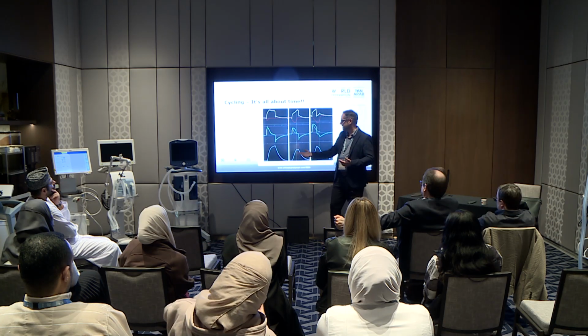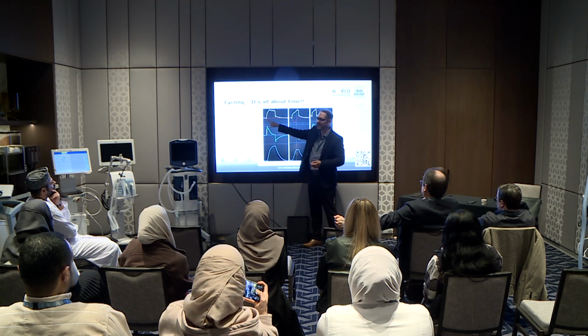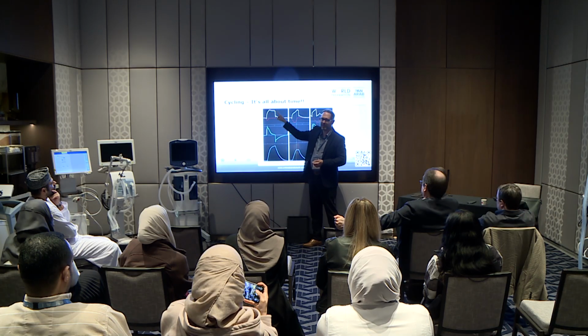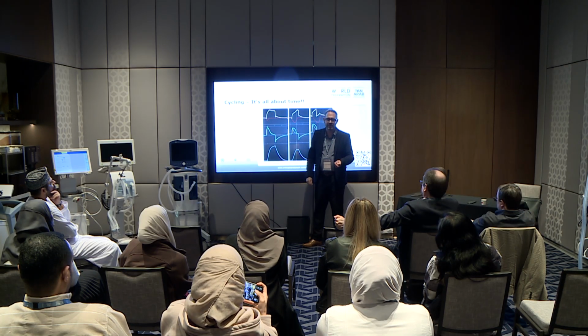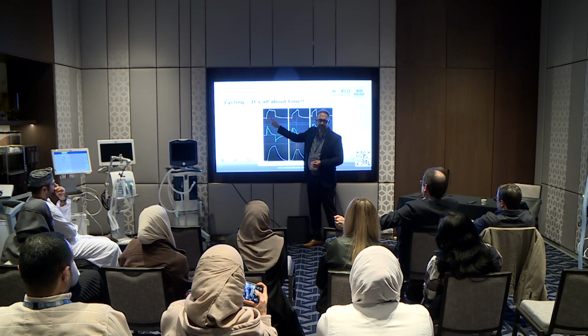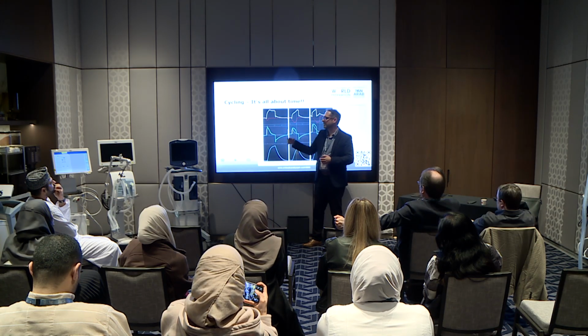So even though they call this normal, I kind of joke because they trigger and technically they're done breathing here, but that's definitely not cycling off normally. But this is a patient who's probably not ready for spontaneous breathing. They have a very weak effort. They're going to start, but that's a normal trigger, and then cycling based on what you would expect.